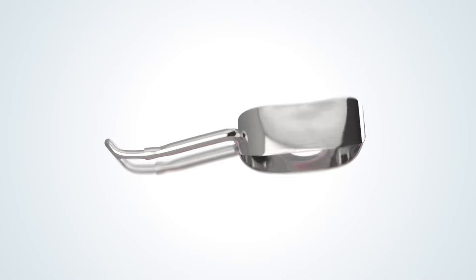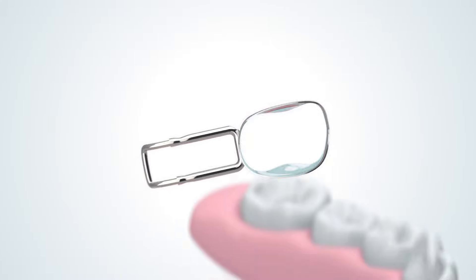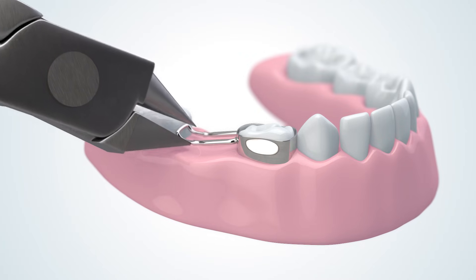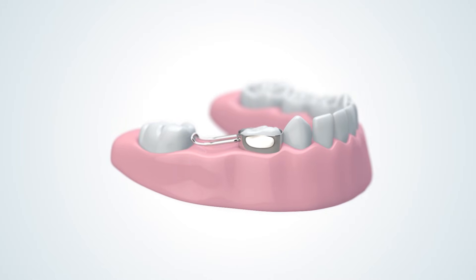Next, prepare your preferred glass ionomer cement. Apply to the interior, gingival side of the band and then cement into place. Perform any additional band contouring or loop curvature adjustments as needed. And just like that, your custom space maintainer is installed.